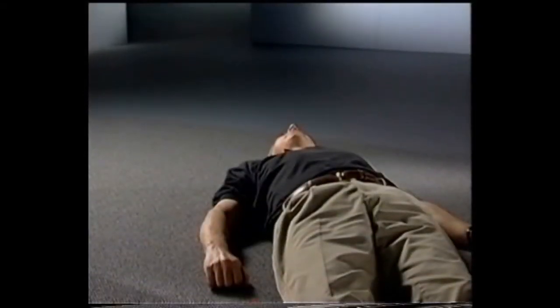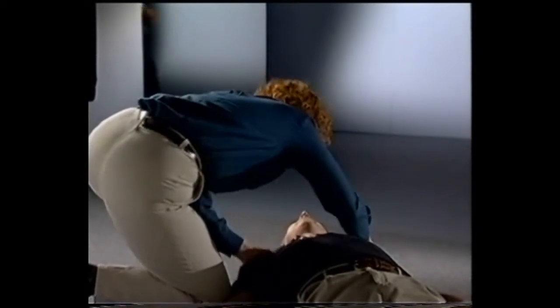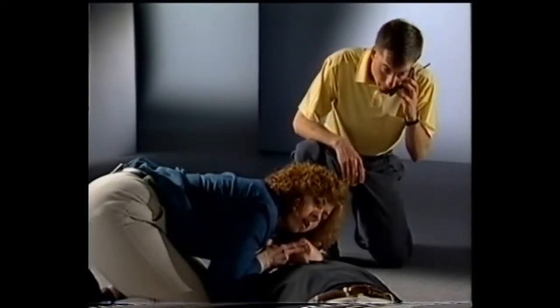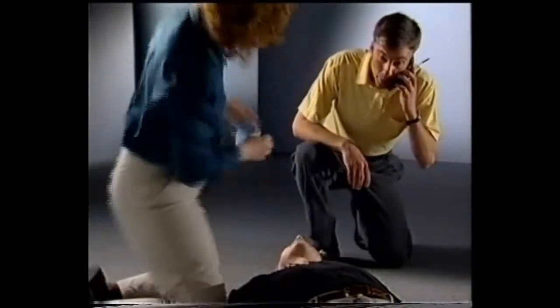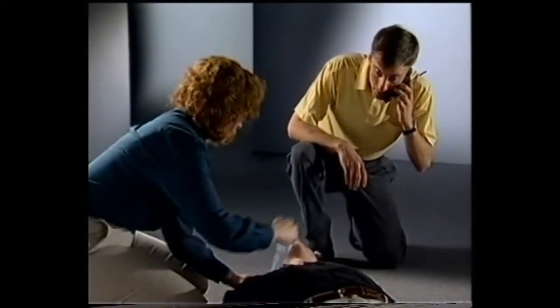If you discover someone who has collapsed, immediately try to arouse them. Sir? If they do not respond, immediately call out for help. Help! When help comes, tell them to call 911 and get the defibrillator. It is extremely important to activate your local emergency response system immediately. Yeah, this is an emergency. We have a man that's fallen down in the lobby. He's unconscious. There's a defibrillator just around the corner. Go get it. Yeah, we've started CPR and we have a defibrillator.